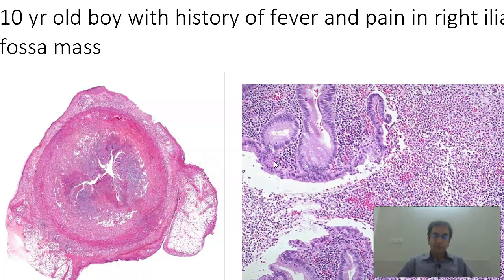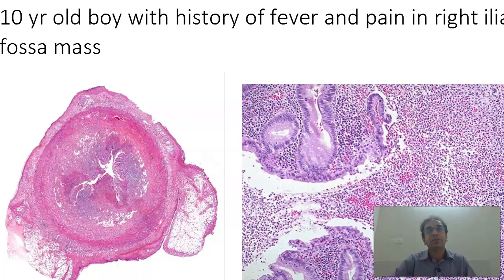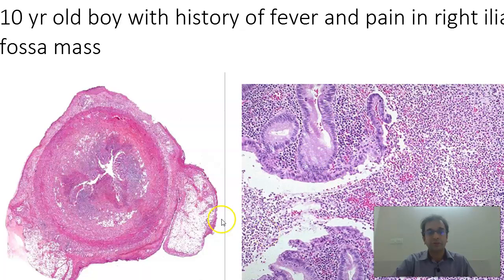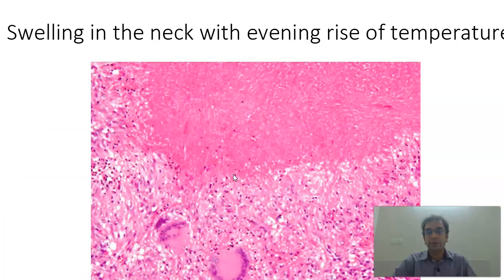The next slide is that of a 10-year-old boy with history of pain in the right iliac fossa mass. At the MBBS level, when you have a patient with a right iliac fossa mass, that hint itself will tell you this is an appendix. The diagnostic feature is that there should be inflammatory cell infiltrate of neutrophils infiltrating the muscularis propria — that is when you diagnose acute appendicitis. In the microscopy, you find mucosal glands with a lot of blue cells, which are neutrophils.